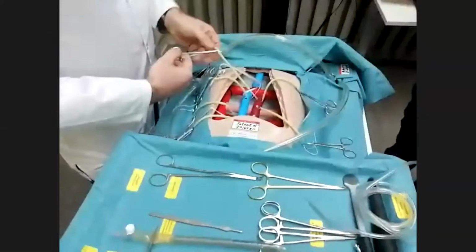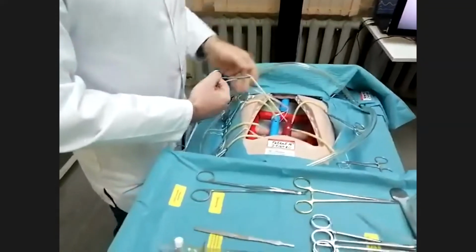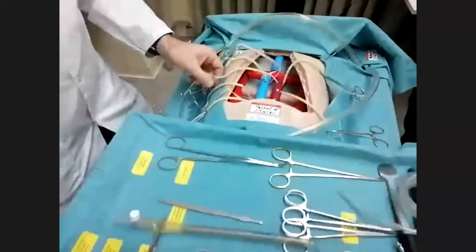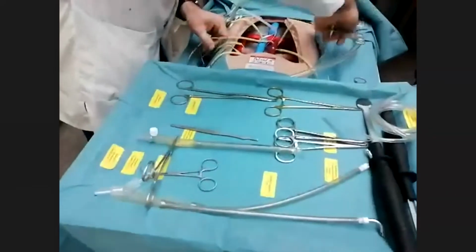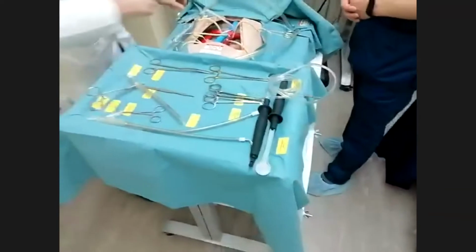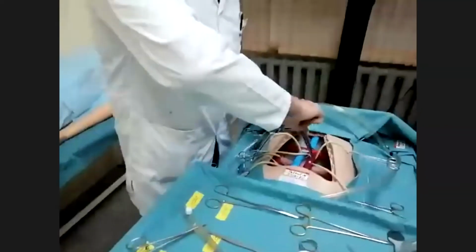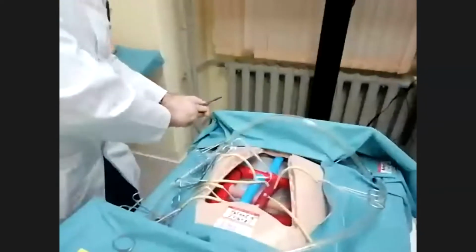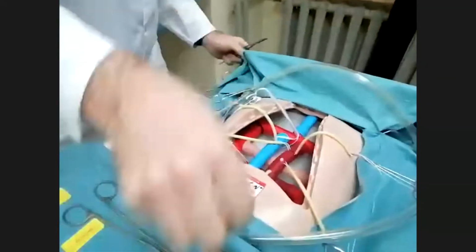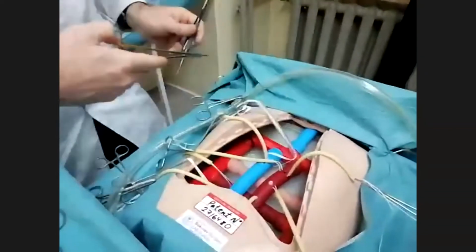The anesthesiologist answers to me, heparin in. After that, I do the imitation of the purse-string, double purse-string stitches on the aorta.